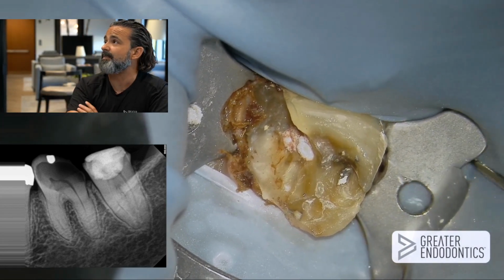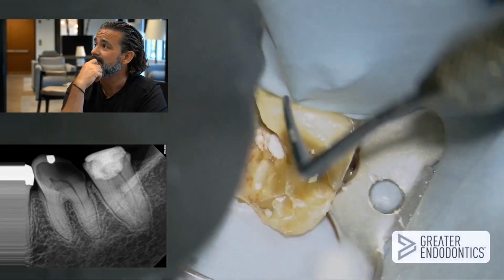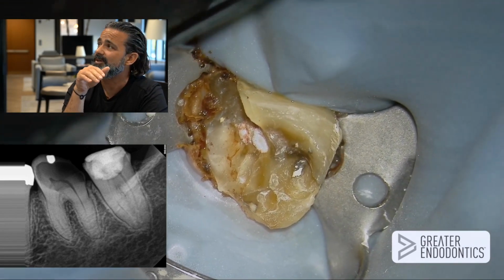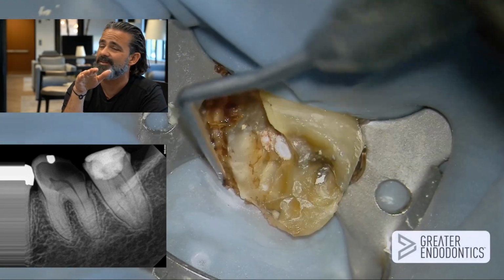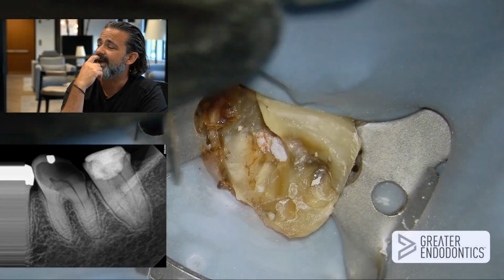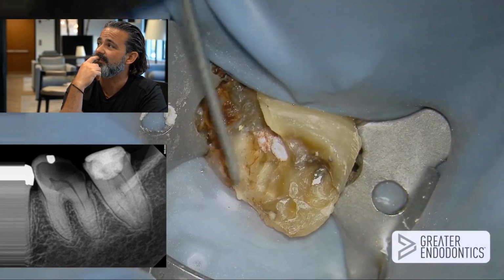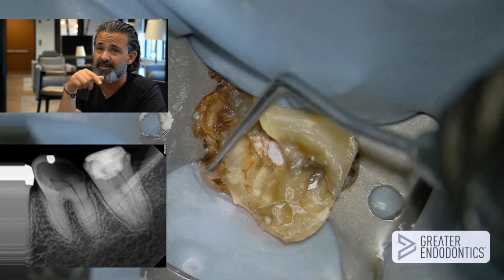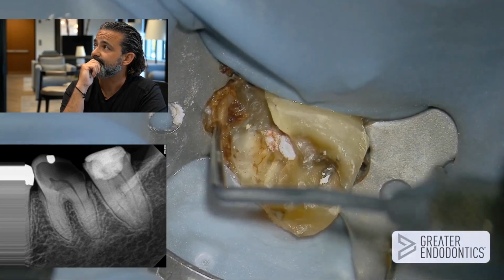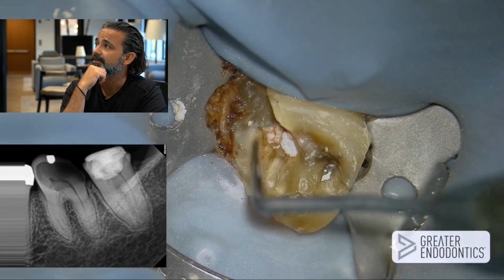I'm going to flip the rubber dam down around the clamp, and then I'm going to actually push on the bow and see how stable it is. And I'm also using an Explorer to tuck it into the sulcus, if you will, on the mesial distal, because that's all that's left of the sulcus. The buccal's gone. And this little tag of gum tissue, I'm just going to try to tuck it underneath the rubber dam so it doesn't get in my way, and if it will really expose the entire circumference of the tooth. And that's what I'm going for. So we're going to tuck that puppy in. It looks like a hot mess, but I got to make it a clean mess. There we go.